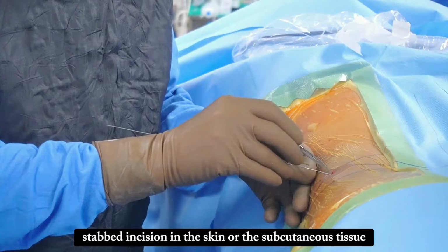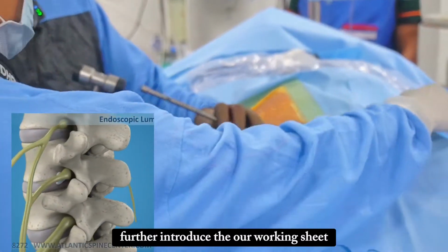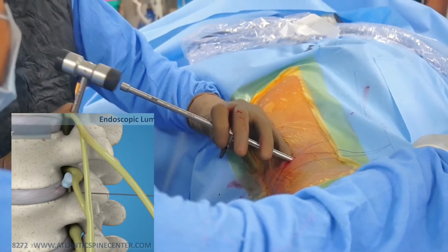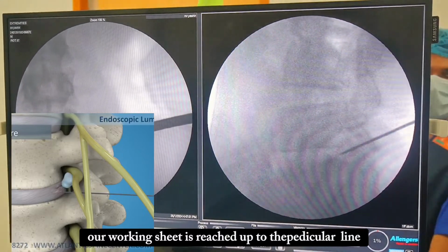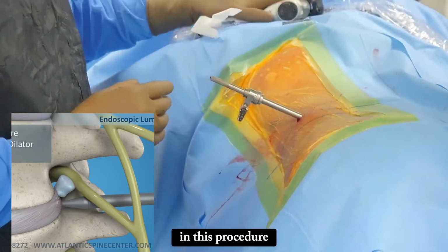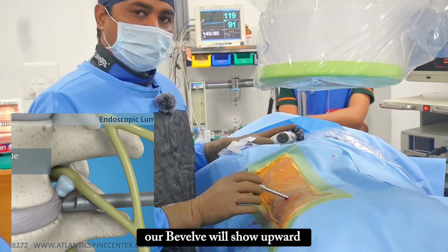Now we will make a small stab incision in the skin and subcutaneous tissue. Further, we introduce our working sheath. The patient may feel some discomfort at this time. We can add some sedation if required. Now we can see that our working sheath has reached the pedicular line. And now it's a very important point to remember in this procedure. When the working sheath reaches the mid pedicular line, our bevel will face upward.